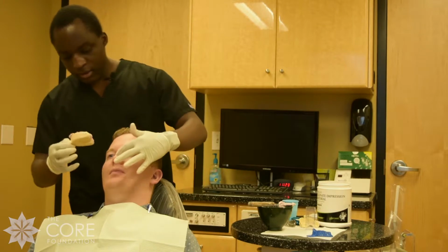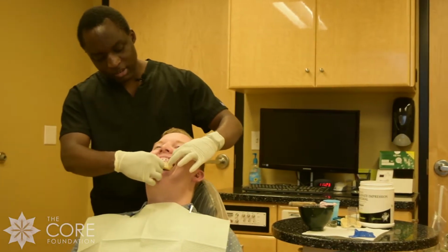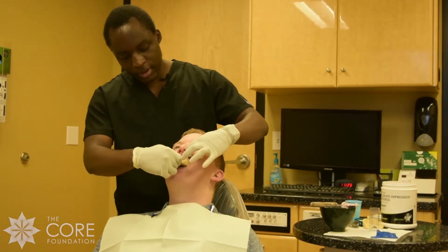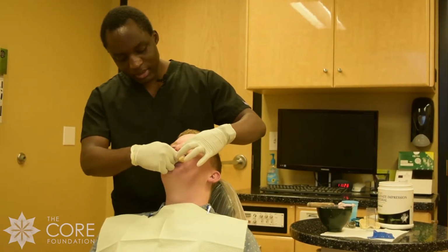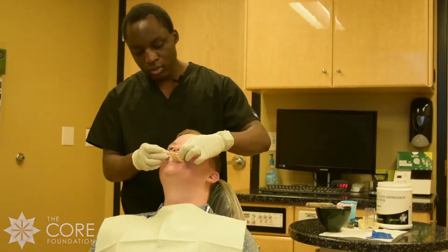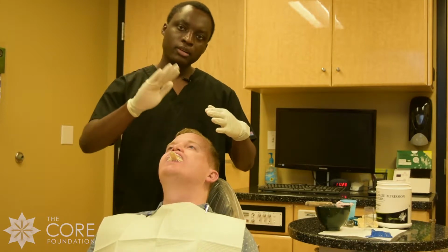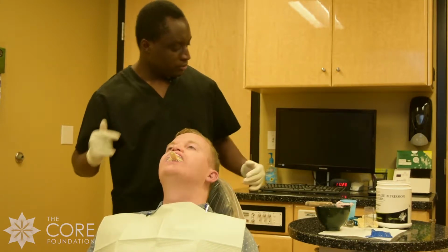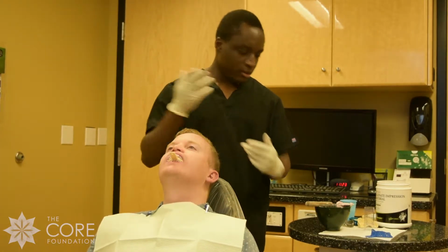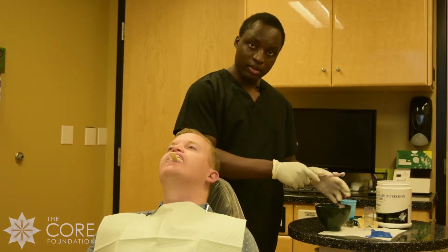And this first technique is called an overhead technique. So go ahead and open. You stand behind your patient, place it in, and go ahead and bite down really hard. And I will fold his lips over. So when the impression is hard, you get a nice ridge over your alginate. And while this is setting, I'm going to go ahead and clean up my materials before it sets, okay?